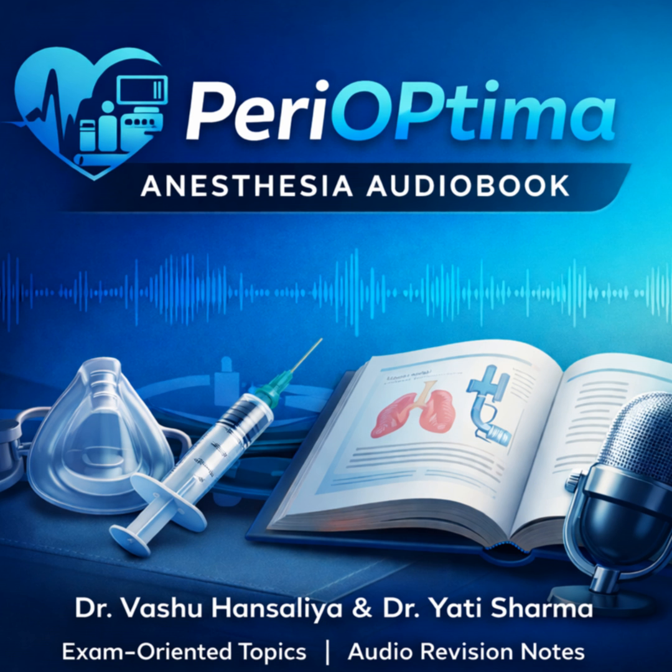Okay, next scenario. A patient with a severe COPD or asthma exacerbation. The number one problem here is not getting air in, it's getting air out. Their airways are obstructed, so the biggest danger is air trapping or auto-PEEP. So how do you set the ventilator?